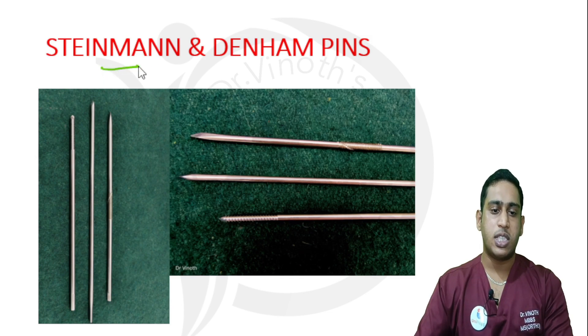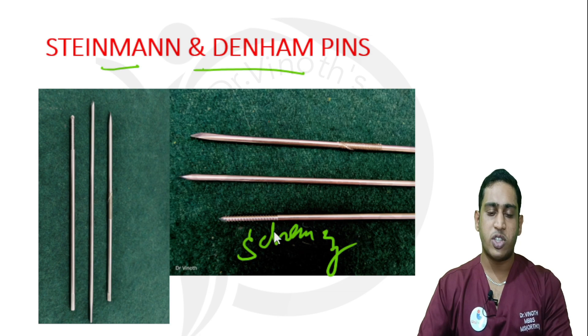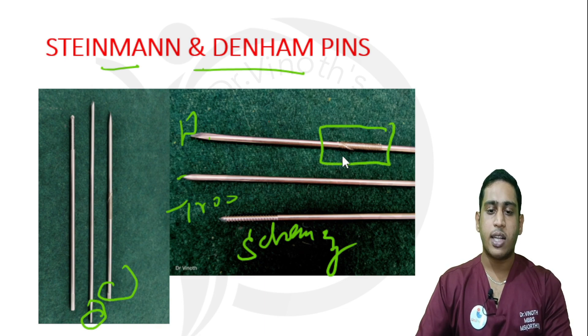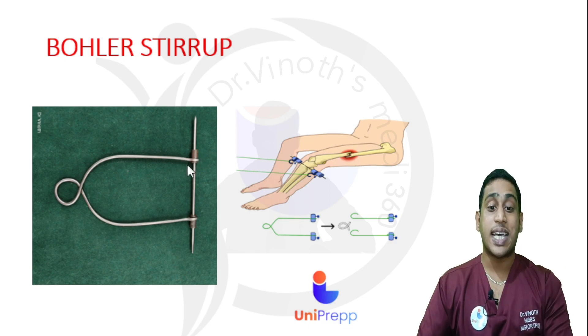Next are the pins: Steinmann pin and Denham pin. The tip of both pins is a trocar tip at one end and blunt at the opposite end. The difference is that in the Denham pin, there are serrations or threads at the center of the pin. Both the Steinmann pin and the Denham pin are useful for skeletal traction.